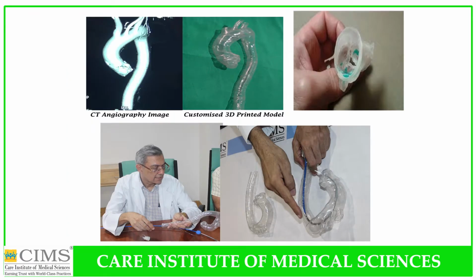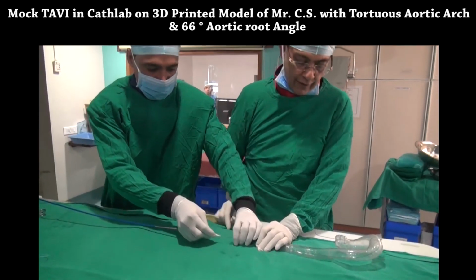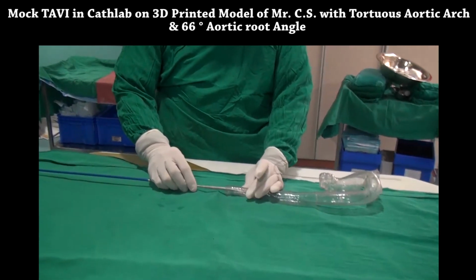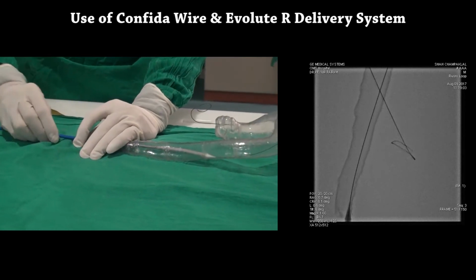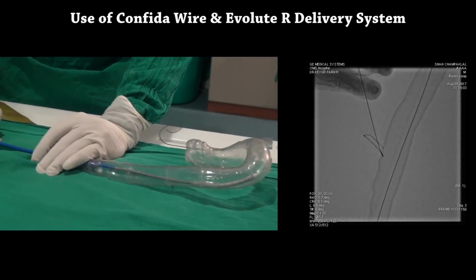Again the CT angiography image followed by center image showing customized 3D printed model, the aortic valve in the far right insert, and the on-table mock demonstration. Subsequently, we took this model to the cath lab and decided to do a mock TAVI in this model using fluoroscopy imaging and the delivery system of the Medtronic Evolut R.